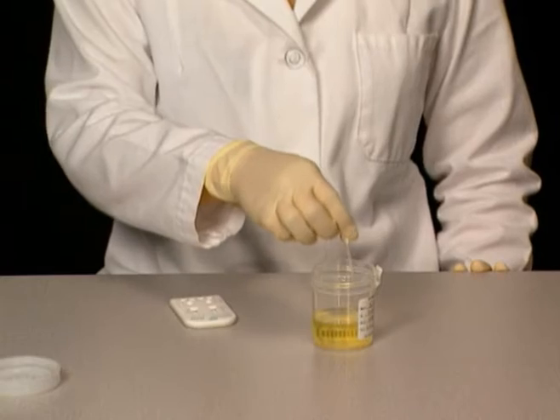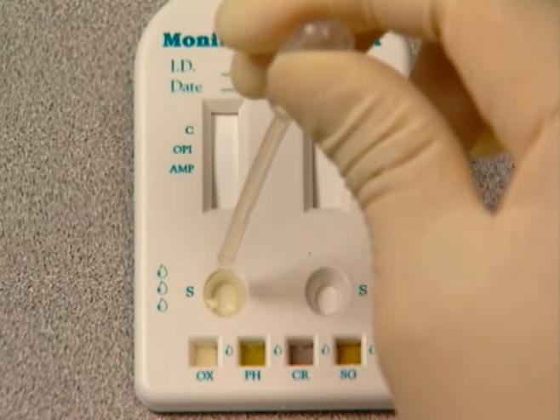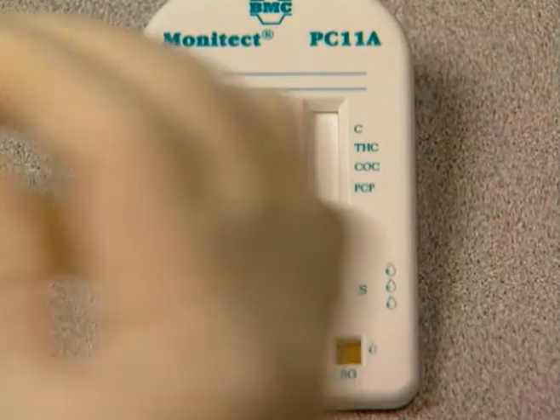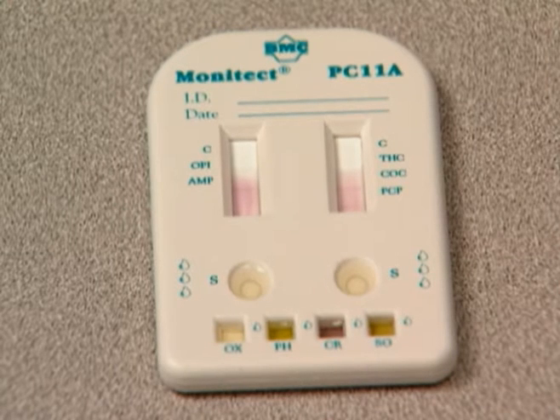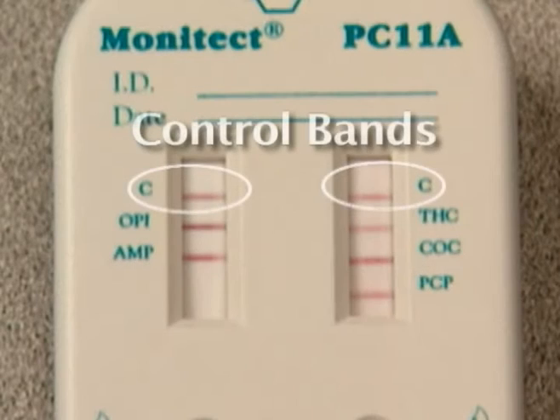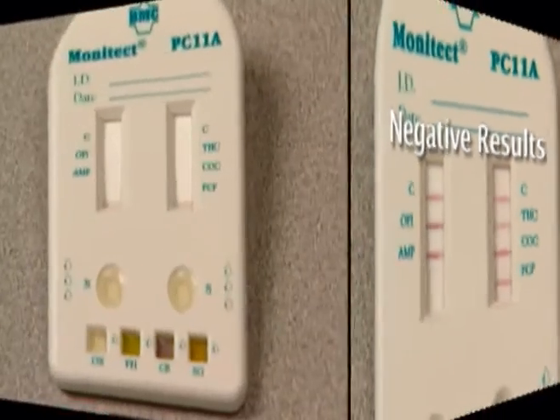Draw the urine sample into the pipette and dispense 3 full drops into each sample well indicated by the S. Avoid adding drops that contain air, since air bubbles may cause an uneven flow or prevent the flow of the sample onto the test strip. Negative results are ready to interpret once the control bands C form. Any colored band that can be seen visually, no matter how faint, is a negative result.